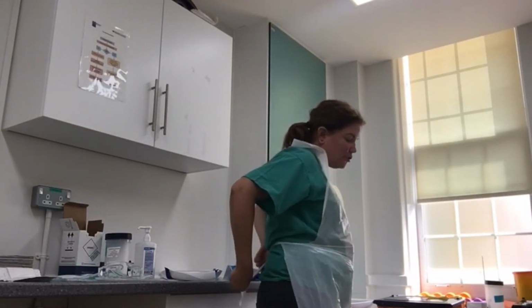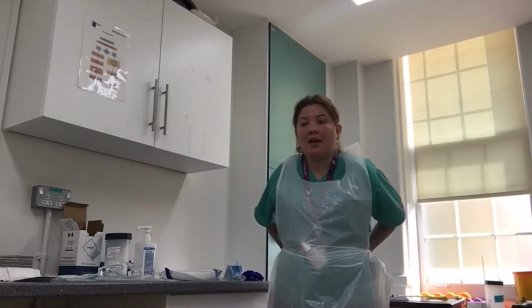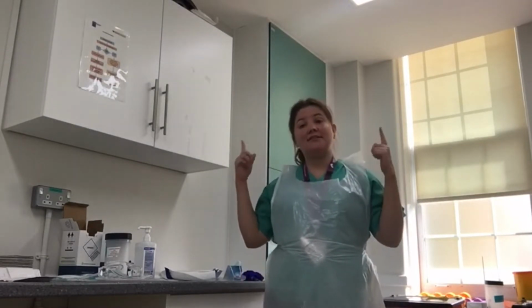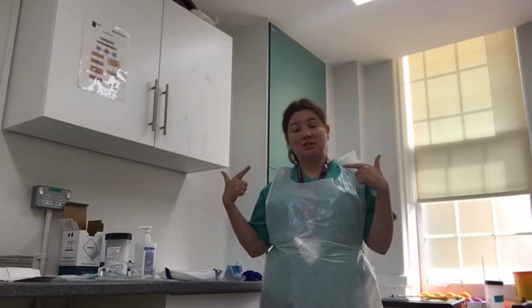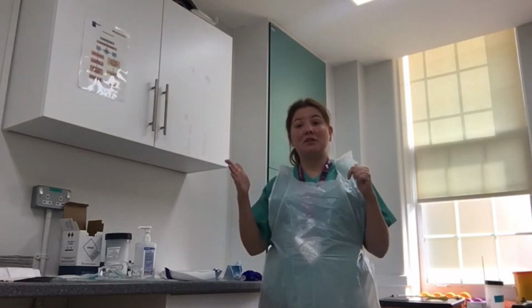Make sure it's secure. And here is a tip. You can keep the eye protection and the same surgical mask when swabbing several patients. However, apron and gloves need to be changed after each patient.